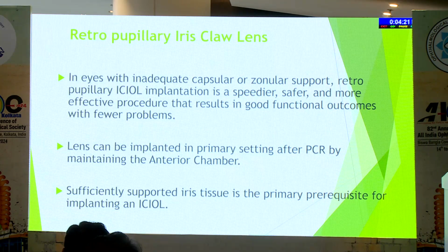One or two things are necessary: your anterior chamber must be clear of vitreous. No vitreous tag should be in the pupillary plane. There should be no distortion of the pupil. Make sure that your AC is free of vitreous, and that you have sufficient iris support.